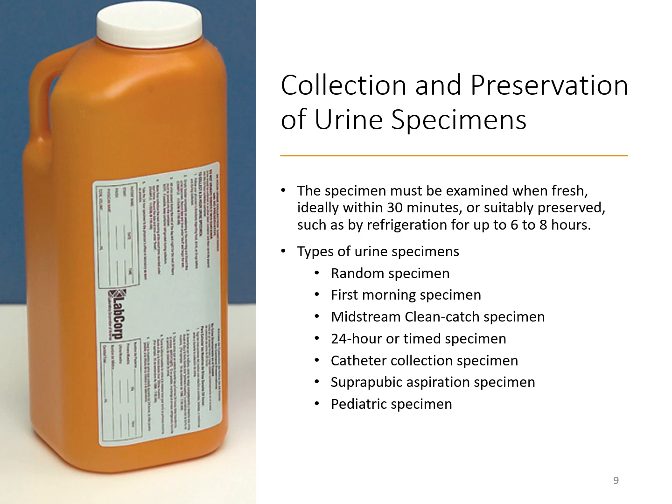And then 24-hour or timed specimens. Timed would be a particular point in the day, and sometimes this is used for hormone monitoring. For a 24-hour sample, you would collect it for a 24-hour period. Usually, first morning sample all the way through the next morning is what you would collect for a 24-hour urine. This would be to look at different analytes and how your body breaks them down and synthesizes them.